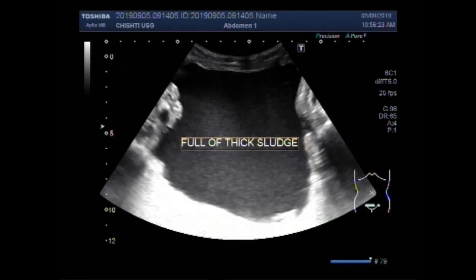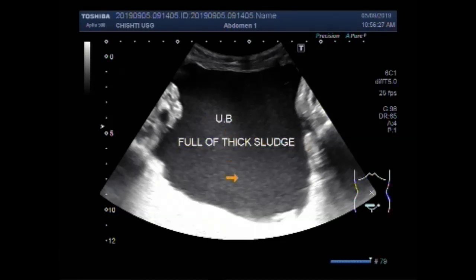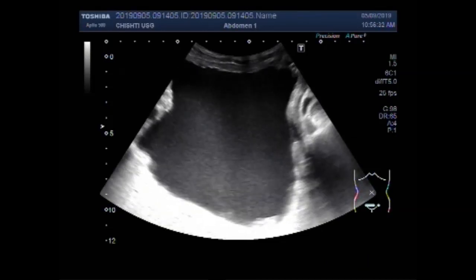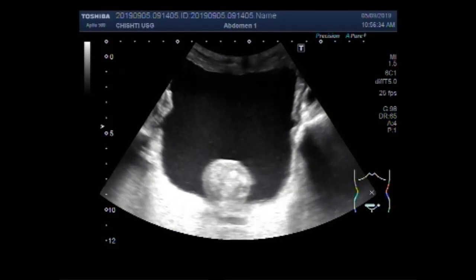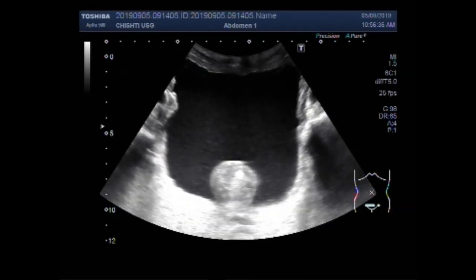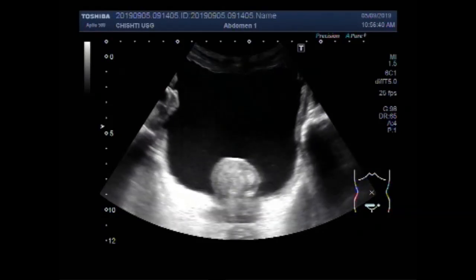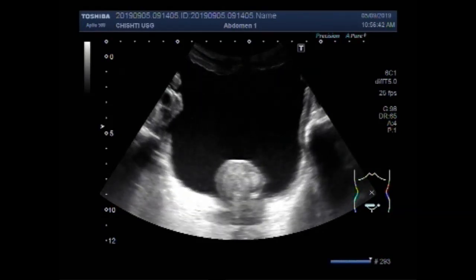This is the picture of the urinary bladder and it is full of thick sludge. Multiple internal echoes are seen, and now you can see a mass — that is a vesicle growth. This is the mass in the urinary bladder.